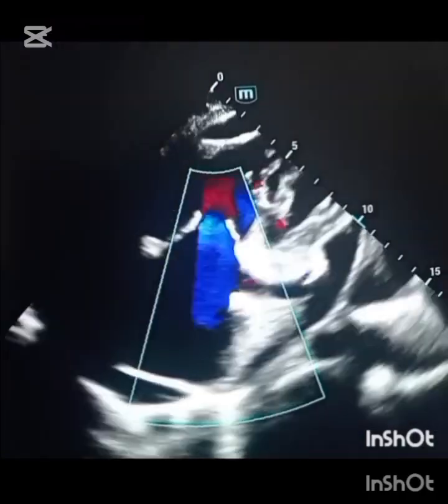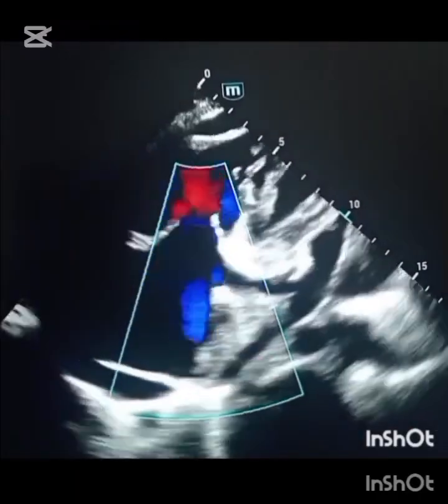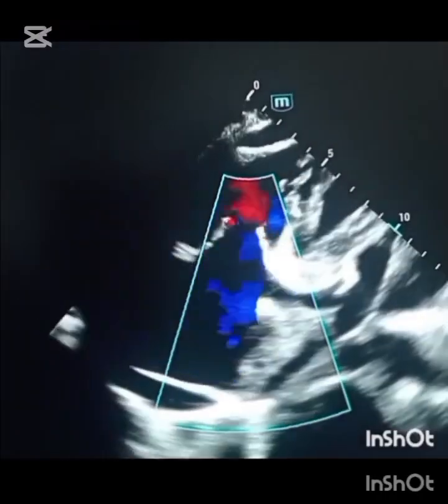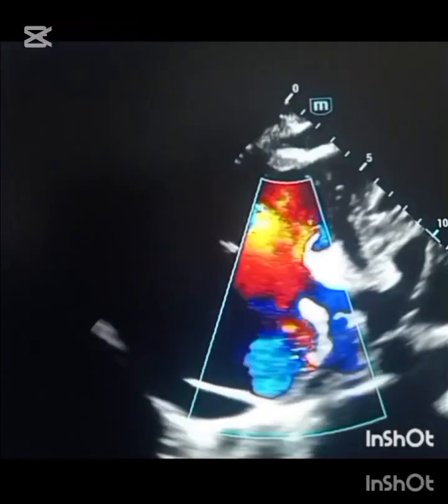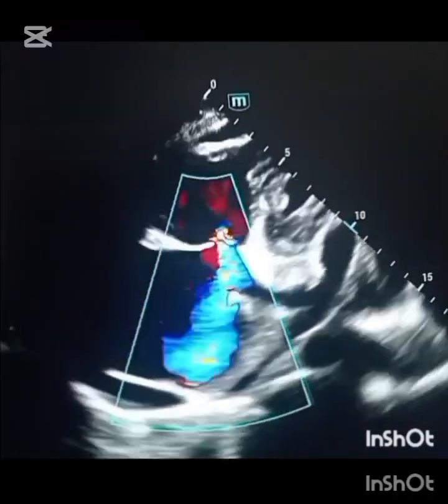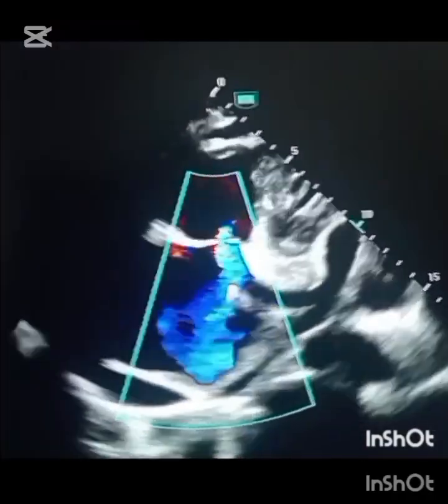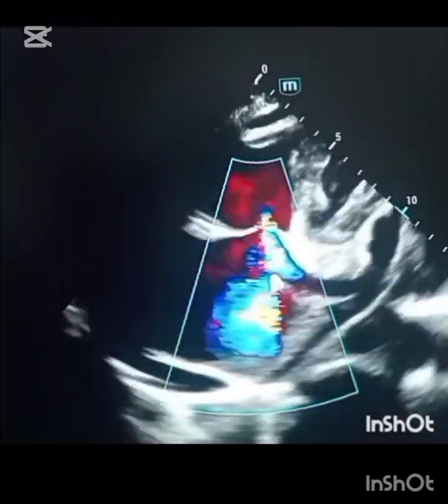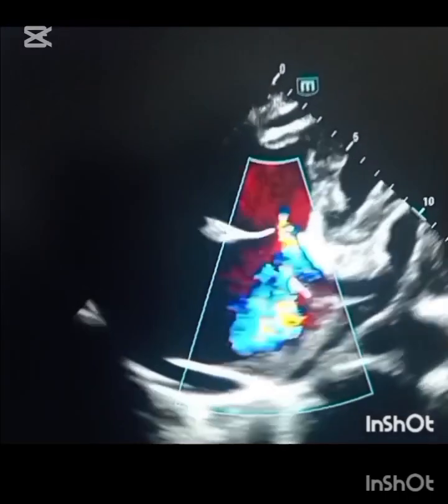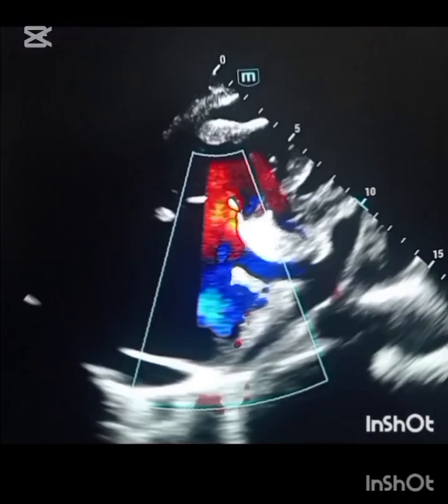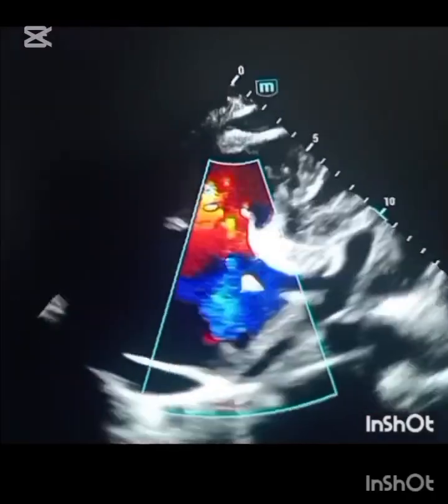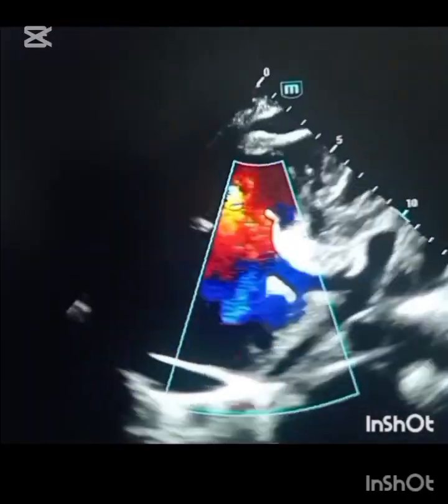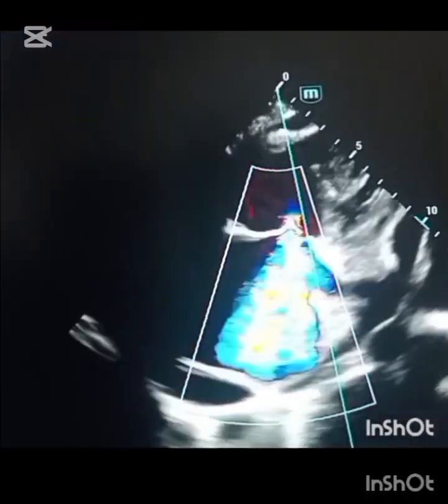For RVSP we need two components: tricuspid regurgitation peak velocity or gradient, and right atrial pressure. Now you can see there is severe tricuspid regurgitation. To get velocity from this, within our routine screening protocol we place the Doppler on the tricuspid valve to obtain the peak regurgitation velocity. The measurements are angle-dependent, so it is crucial we place the Doppler for maximum TR gradients in multiple windows. We take the peak velocity and report the value in meters per second.